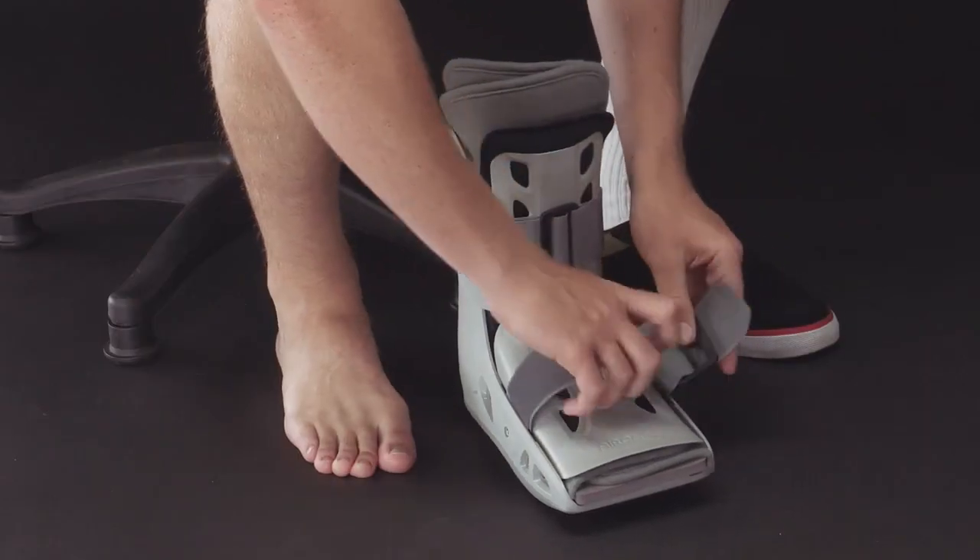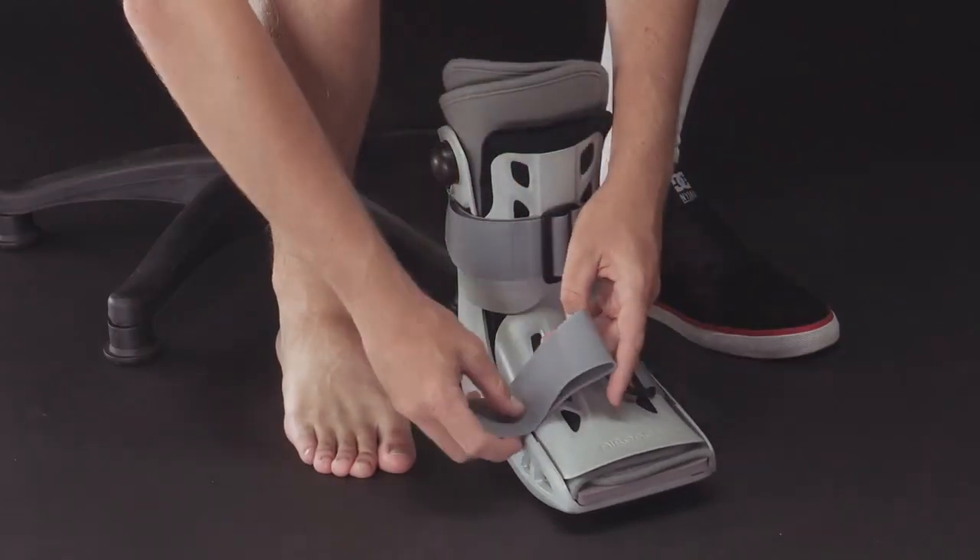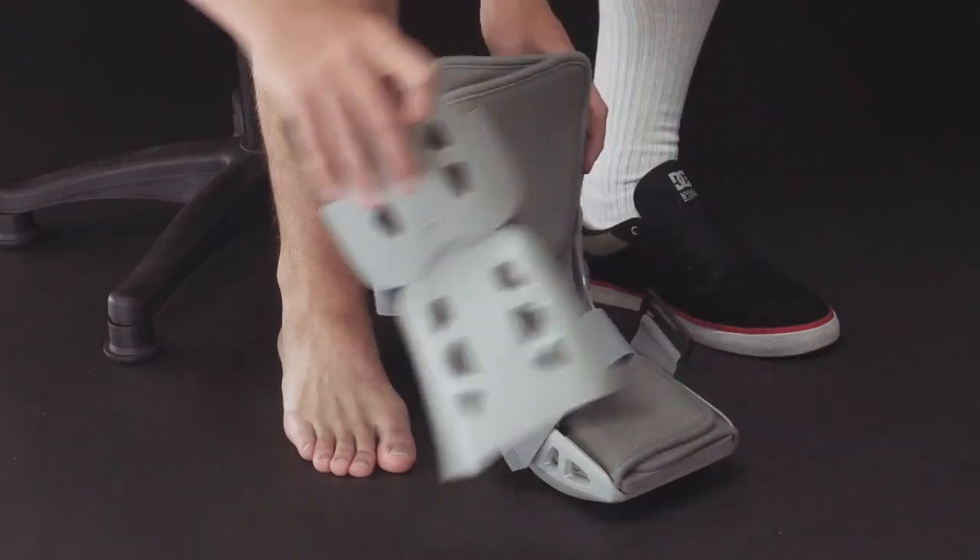To prepare the AirSelect short, unfasten the straps, remove the front panel, and open the liner.